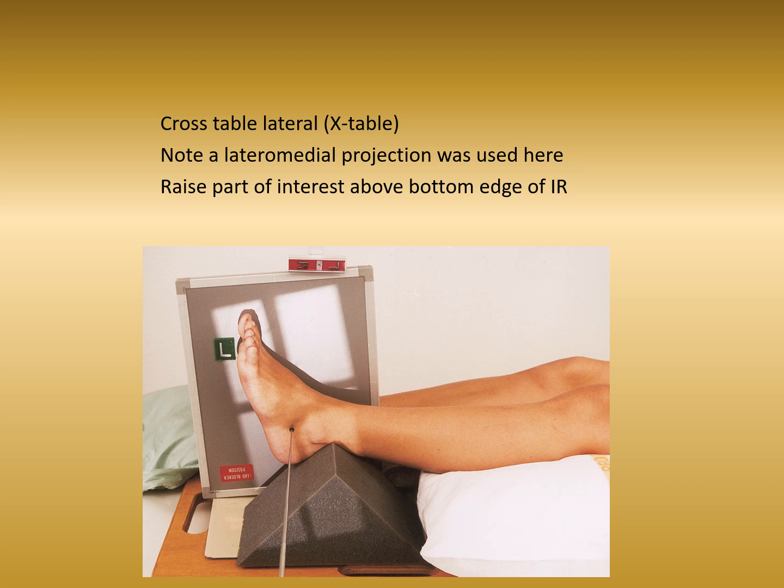Notice that this is a lateral medial projection because there's their pinky toe. All right, so we're entering on the pinky toe side, exiting on the big toe side here. So that is a lateral medial projection, cross table, trauma, foot.